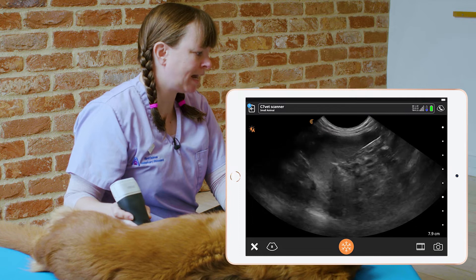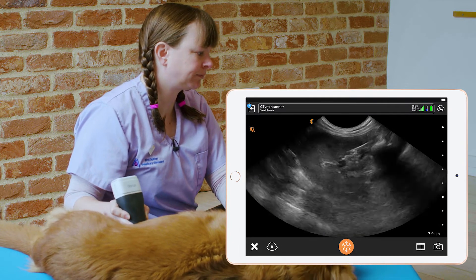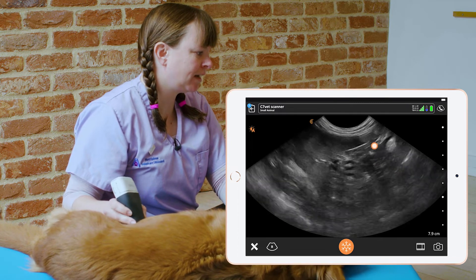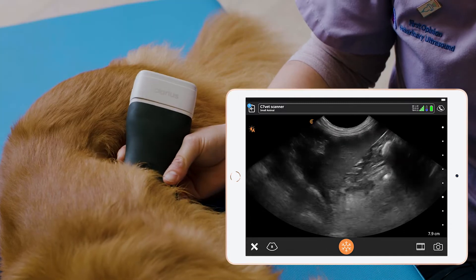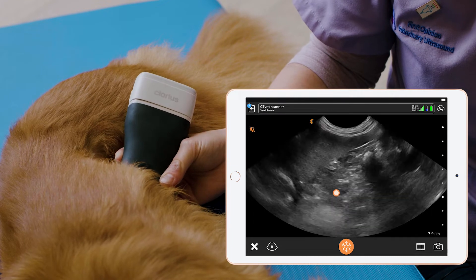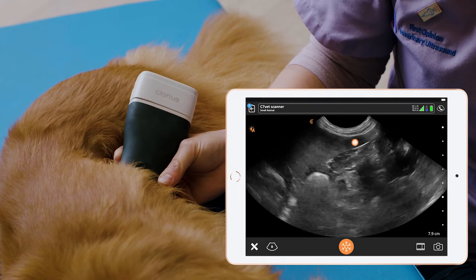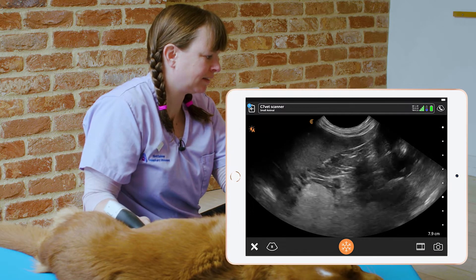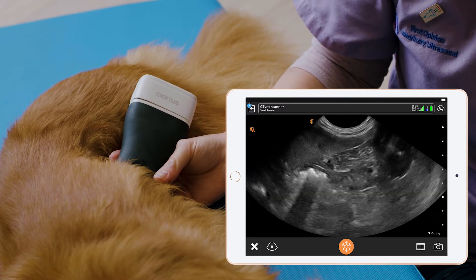We want our three landmarks in the image: we want our stomach cranially, the spleen dorsally, and the transverse colon caudally. So in this area cranially we have the stomach, caudally we have the transverse colon, and dorsally we have the spleen. We can see the splenic vein leaving the spleen, and it's in this area we'll see the left limb of the pancreas.